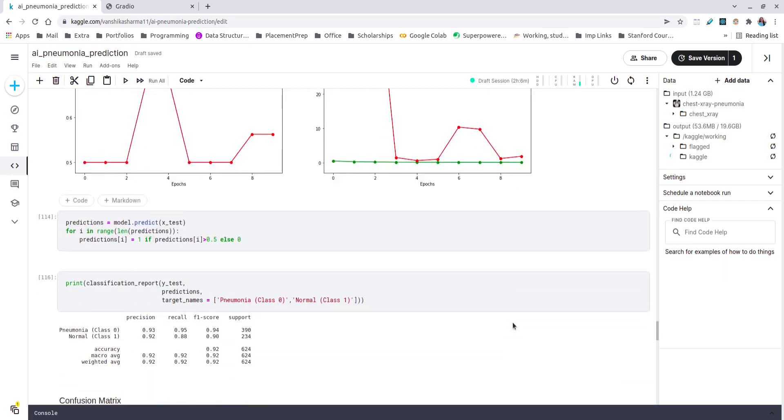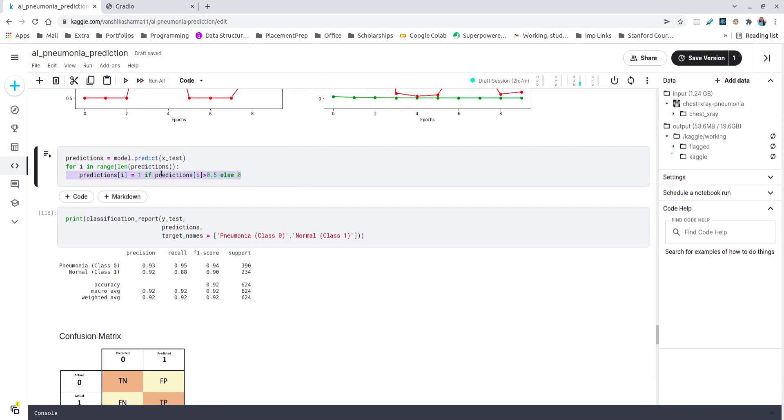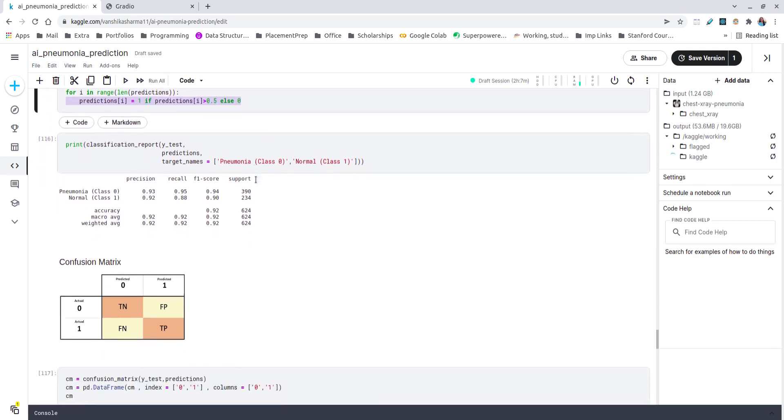A simple prediction—this model.predict function gives me the probability which the sigmoid function gives us. Then I just put a threshold value of 0.5 and map to one or zero according to my needs. Then I've put on a classification report which gives me precision, recall, F1 score, and support. It's pretty decent—0.93 and 0.92. The recall weighted average is 0.92 and they're all above 90%.